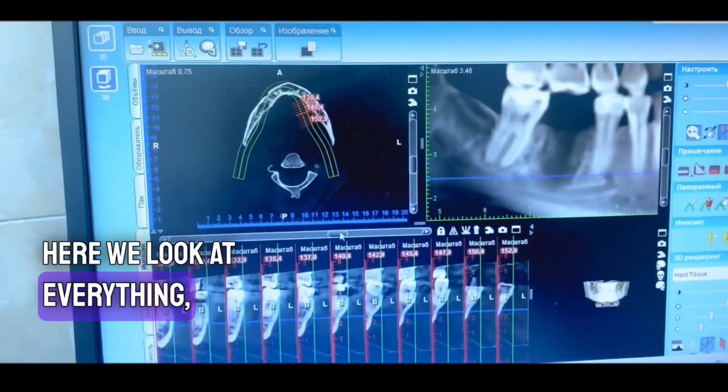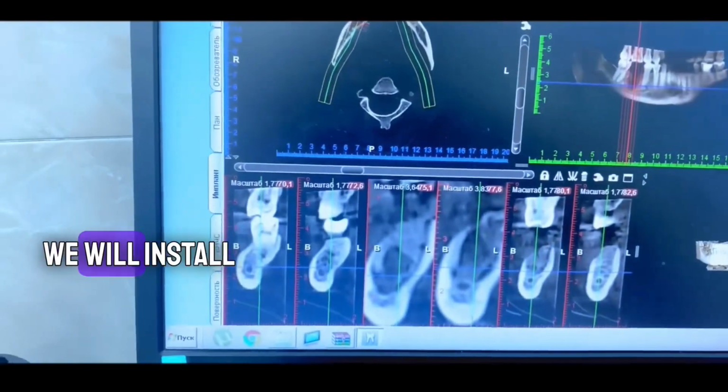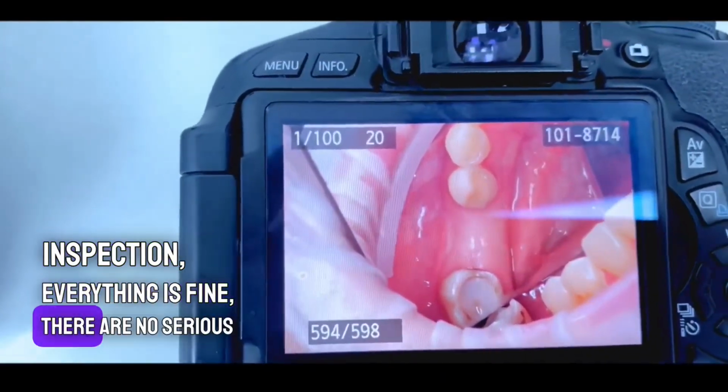Here we look at everything, measure everything, and we see such a picture. The area of darkening, some strange voids that confuse me. But I think I'll go along the way. We will install a plug if we do not receive a torque, and so on. During a visual inspection, everything is fine. There are no serious defects.